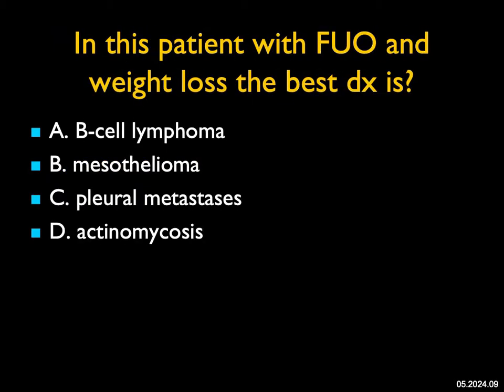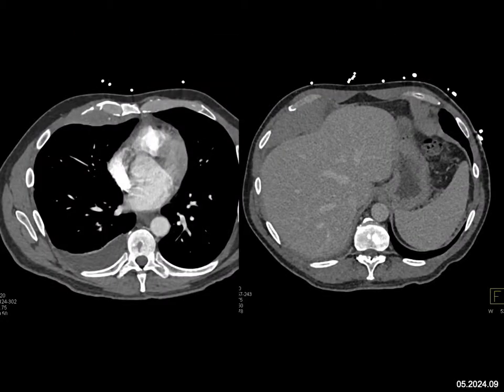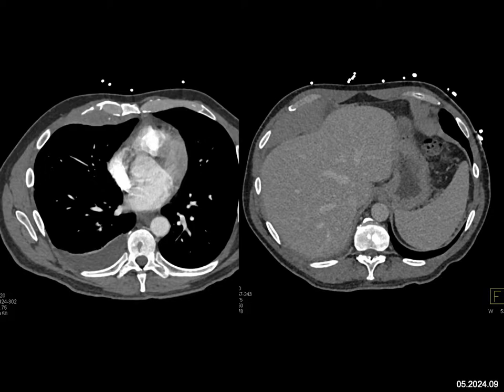In this patient with FUO and weight loss: on the first axial image, you see soft tissue infiltration of the pleura, possibly extending through to the chest wall anteriorly, along with a pleural effusion. On the lower scans, there's infiltration of the pleura again at the level of the diaphragm and liver. Mesothelioma is a consideration — it can be multifocal — but it's usually associated with asbestos exposure and I don't see any calcified plaques.